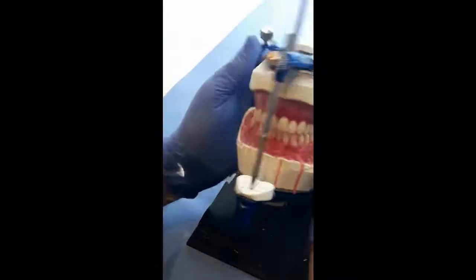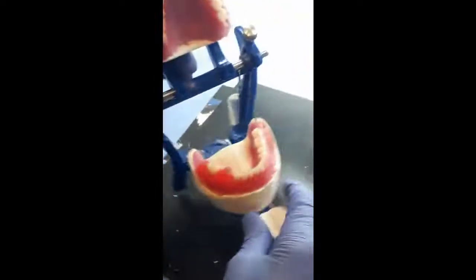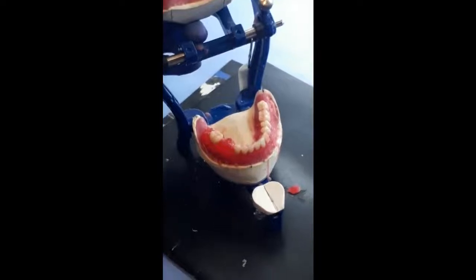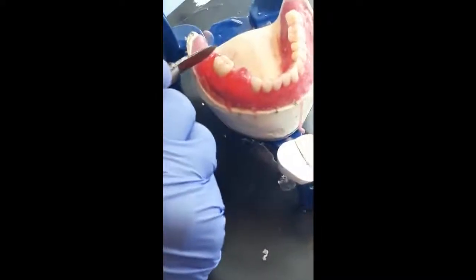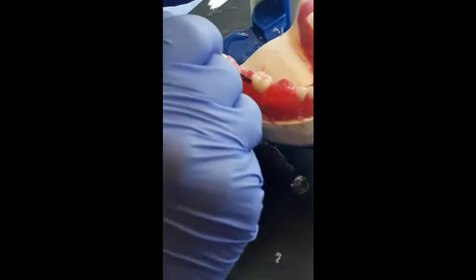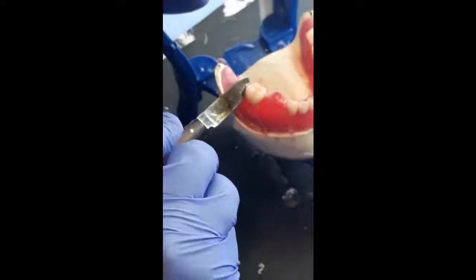This will be explained in a minute in a diagram. I will proceed now to set the second molar, the second mandibular molar, as we did in the left side.